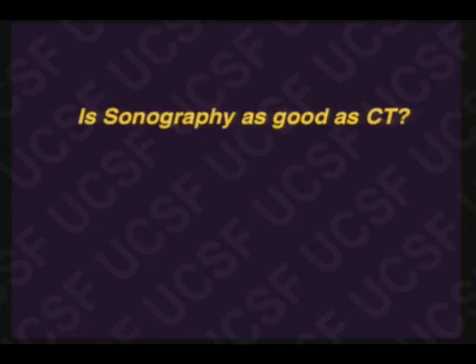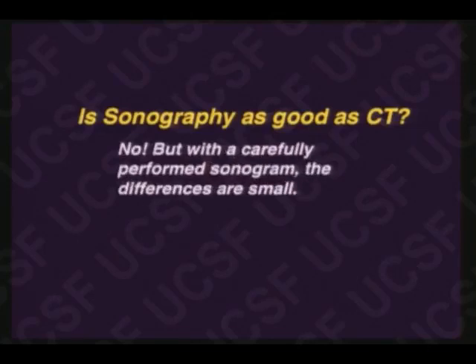Well, the first question we have to ask ourselves is, is sonography as good as CT for finding abscesses? And the answer is no. But I can assure you that with a carefully performed sonogram, the differences are rather small. And if you want to take your CT scanner and your MR scanner, and I'll take my ultrasound scanner, and we'll duke it out, you may beat me, but you won't have a very easy time of it.